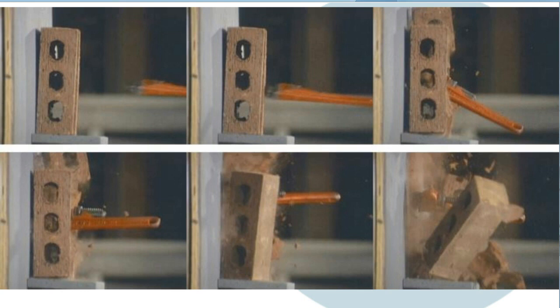If you follow the frames 1, 2, 3, 4, 5, 6, what you see is a wrench flying at the MRI under no power other than the magnetic attraction from the MRI scanner. That wrench strikes the bricks and pulverizes the one that it hits. And in the last frame, you can see bits and fragments of dust, shrapnel, if you will, of the pipe wrench striking the brick.